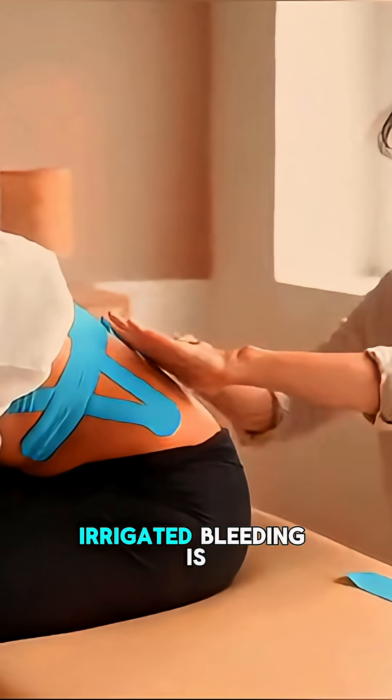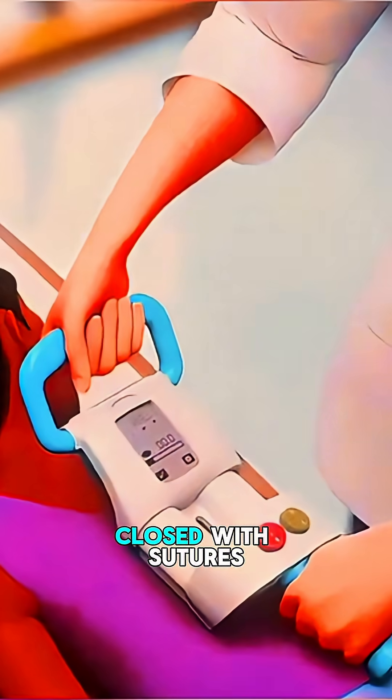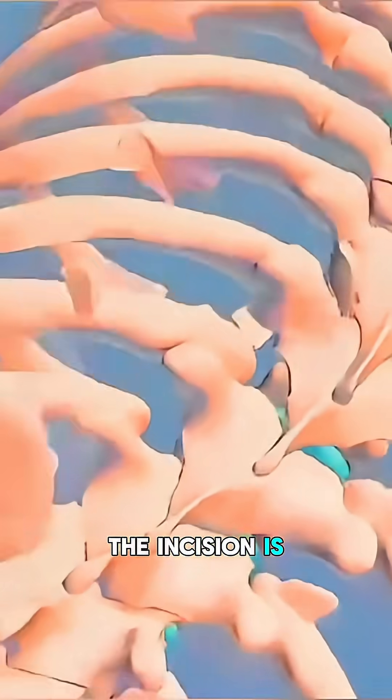The area is irrigated, bleeding is controlled, and layers are closed with sutures or staples. A drain may be placed and the incision is bandaged.